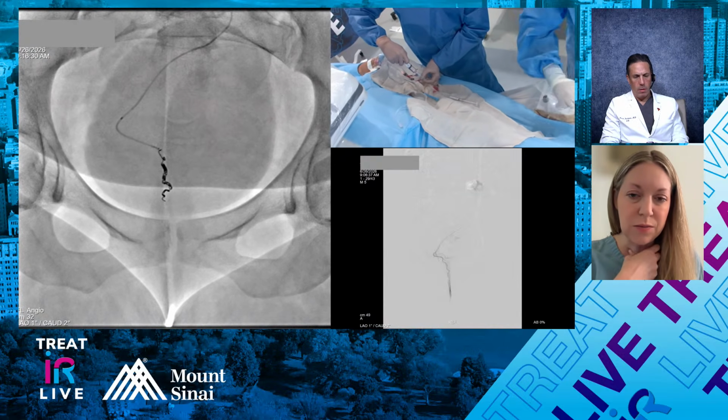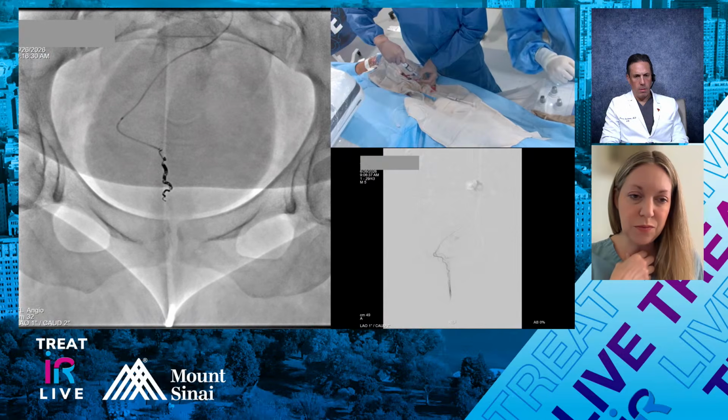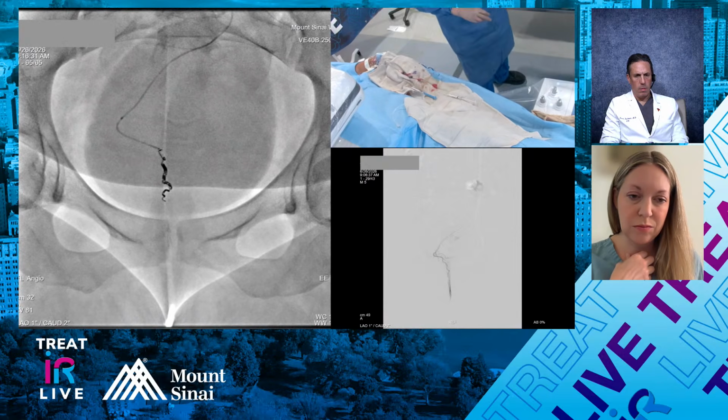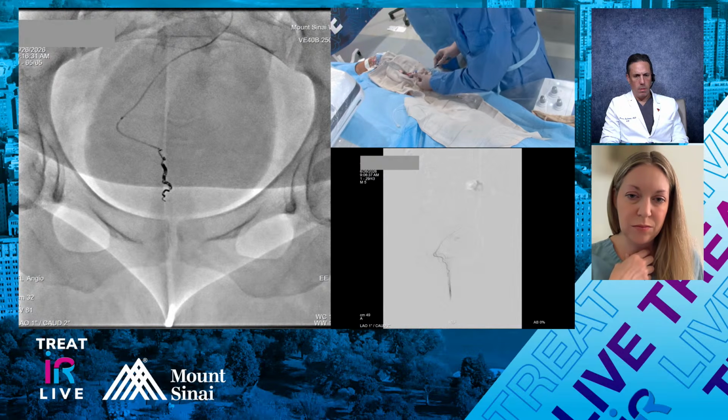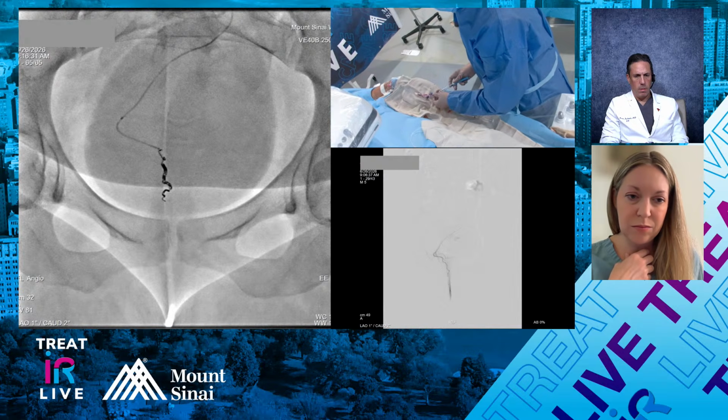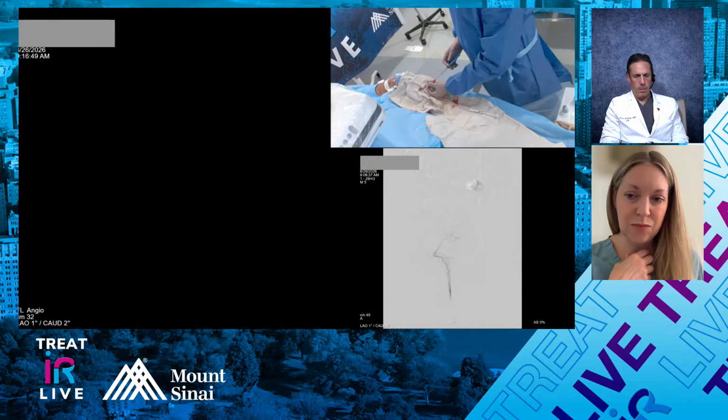When I started, I would put slightly shorter coils, and then I ended up putting more. I think a lot of people had that experience. And then eventually, we just get comfortable with the length that we want. Kind of like Jade just comes out of a holster, he says 315, and it landed perfectly.